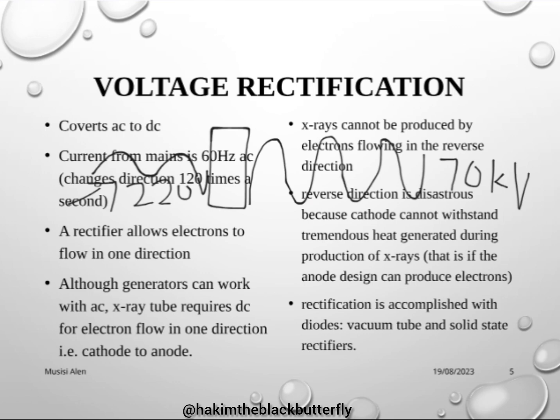Now, within the same generator, we have what we call rectifiers. We have seen that we have a step-up transformer in that generator. Now we have rectifiers.